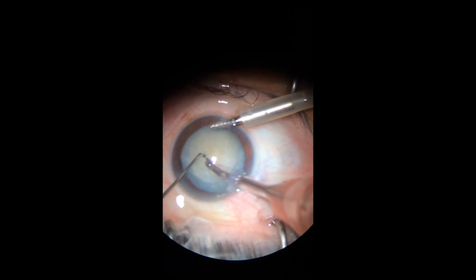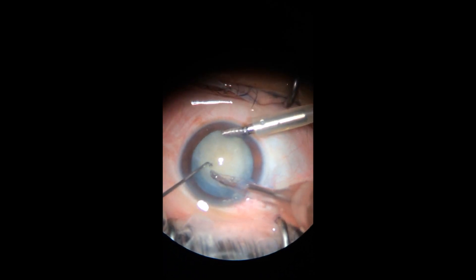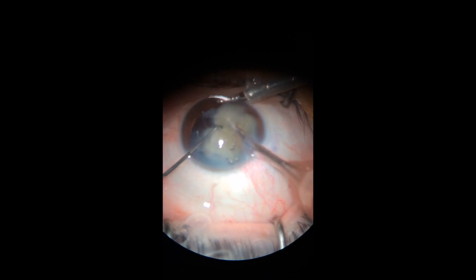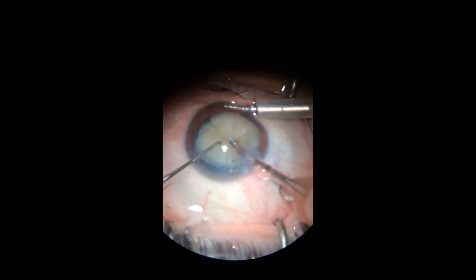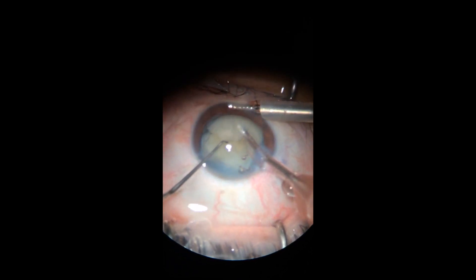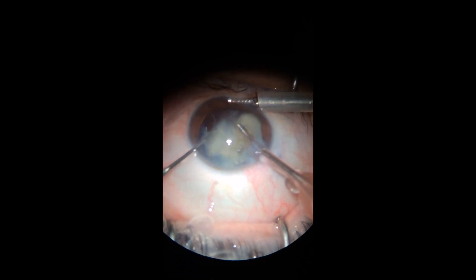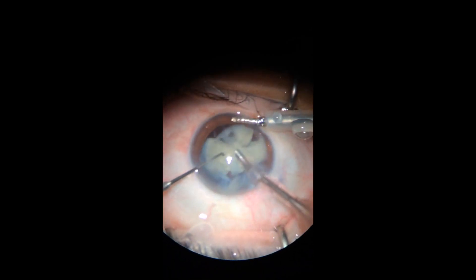Right when I started the phacoemulsification, I noticed that rubbery membrane. At the beginning of phaco I didn't try to peel it off — it couldn't come out, so I pushed it aside and finished the phacoemulsification. Then I tried to deal with that membrane.